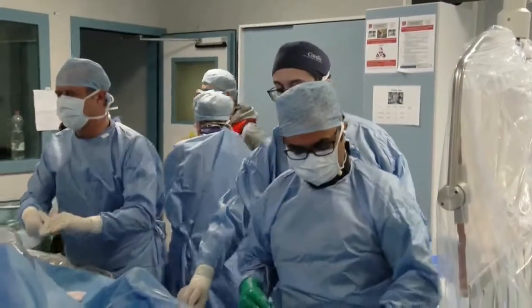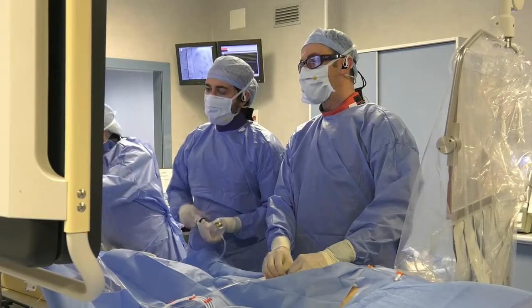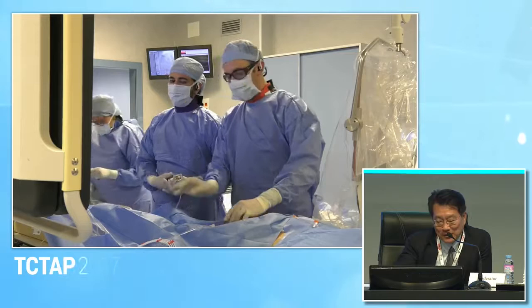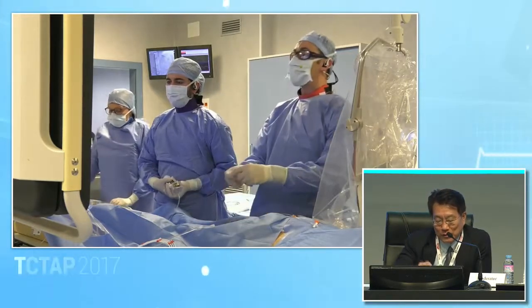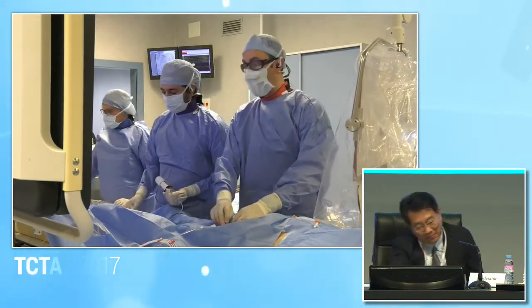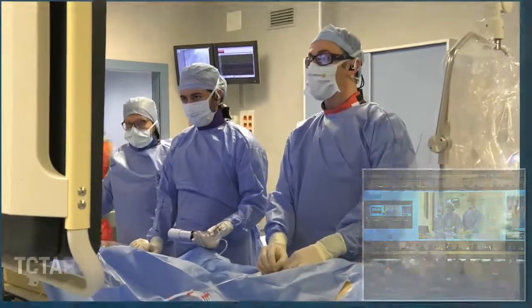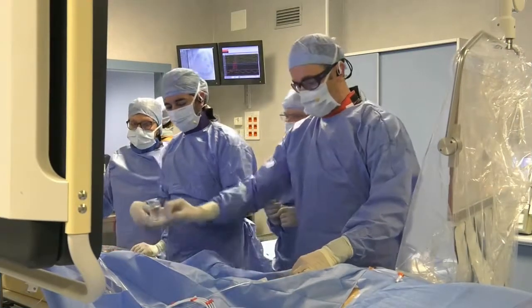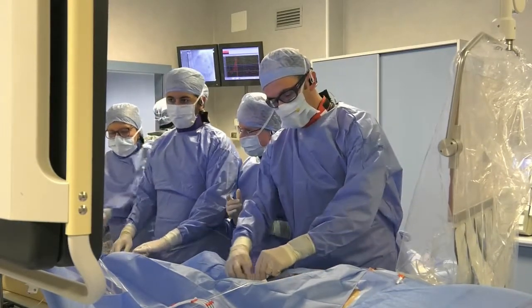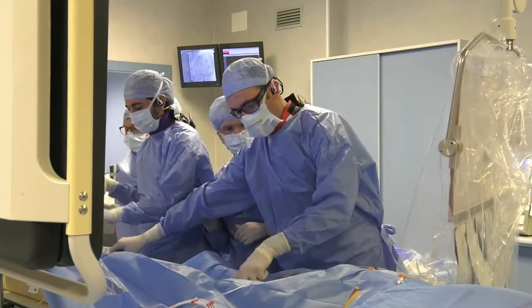Let's go in the other room. Antonio, it is a kind of an old concept, the therapeutic dissection with a balloon, you know, and big dissection. Antegrade flow is good, the luminal area is good. As usual, you know, totally different. And in addition, I believe that segment of the LAD is intramyocardial, and I don't like to stent vessels in the intramyocardial segment.